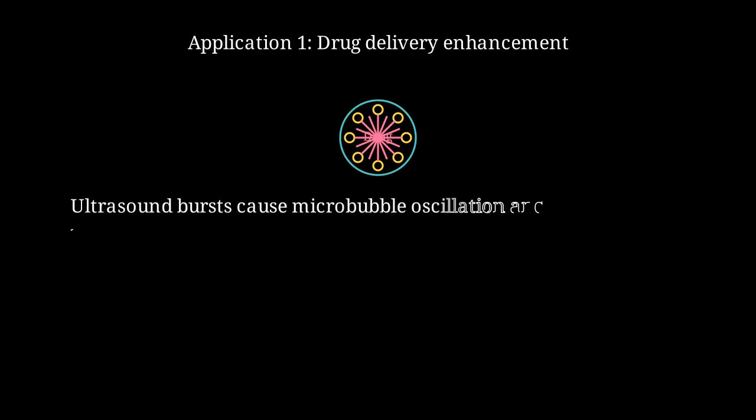When ultrasound bursts are applied at the target site, microbubbles oscillate violently and eventually rupture. The pressure threshold for microbubble destruction ranges from 0.5 to 2 megapascals.